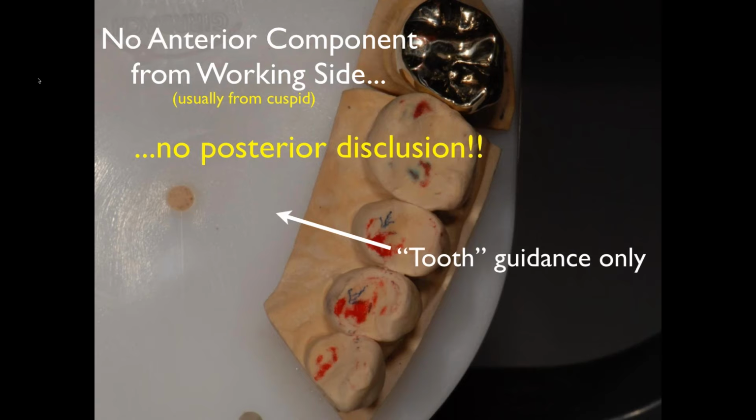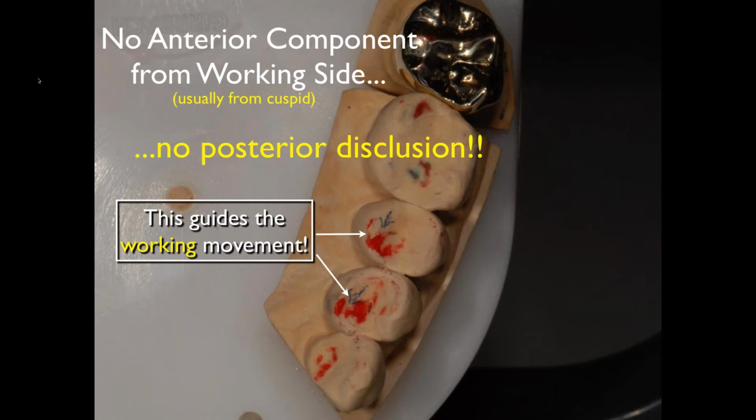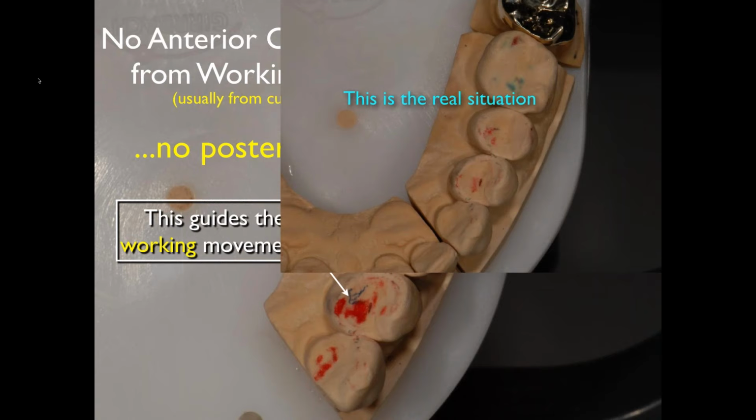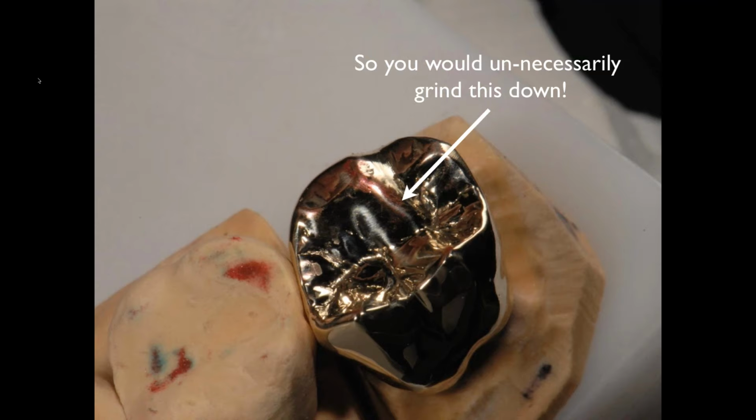So understanding this though is really important. You may choose maybe not to want to make this crown on this kind of a situation if possible, all right? Because here's the real situation, as opposed to what we're seeing on this articulator. And what it does is we perceive this big interference, this balancing side interference on this case here, which really isn't there. So we will grind this down flat, which you need to do to get it to harmonize without any anterior component, and we will screw this crown up unnecessarily.